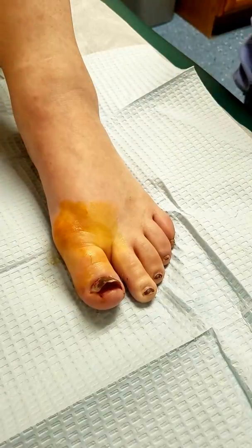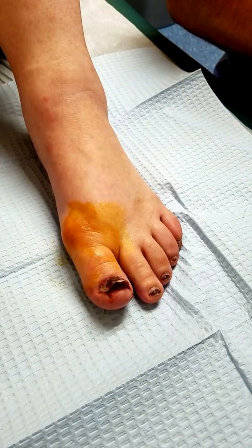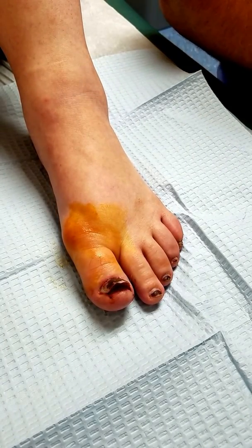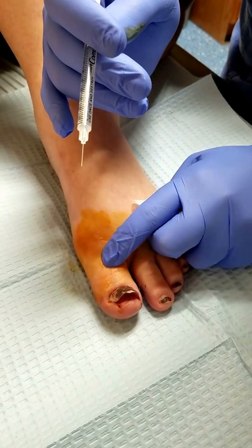So what we're going to do is something called a digital block. We're going to block the nerves at the base of your toe. You'll feel a really small poke with a small insulin syringe first before we use the bigger one.